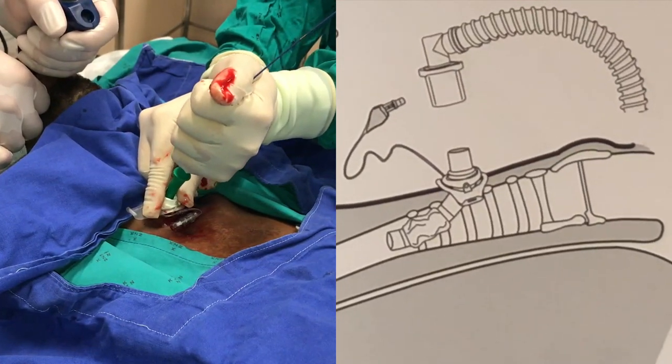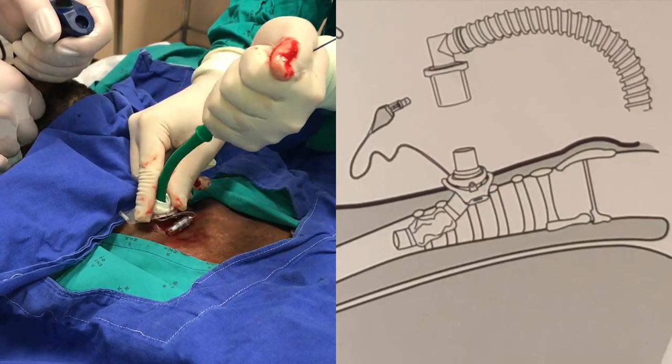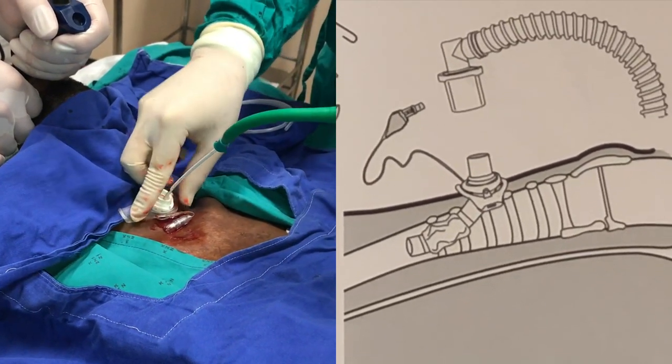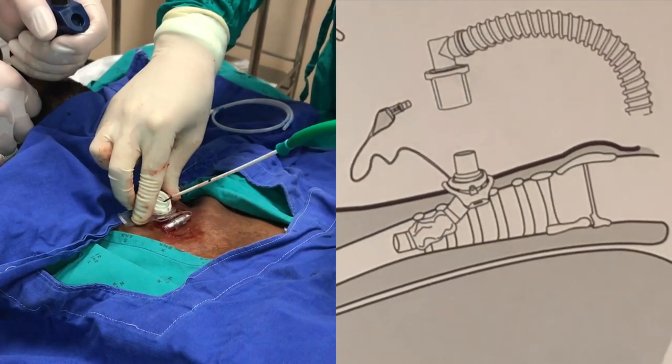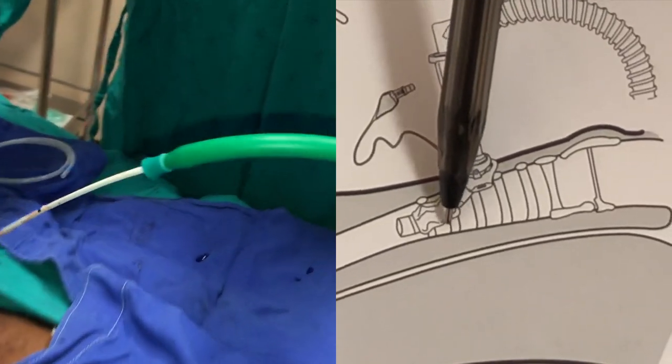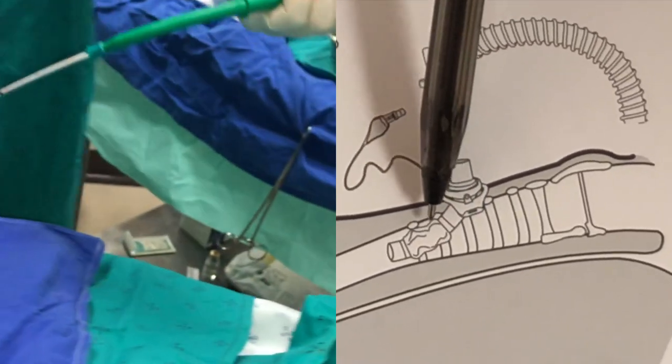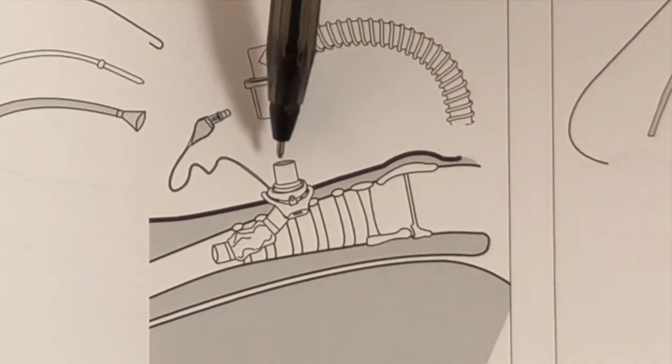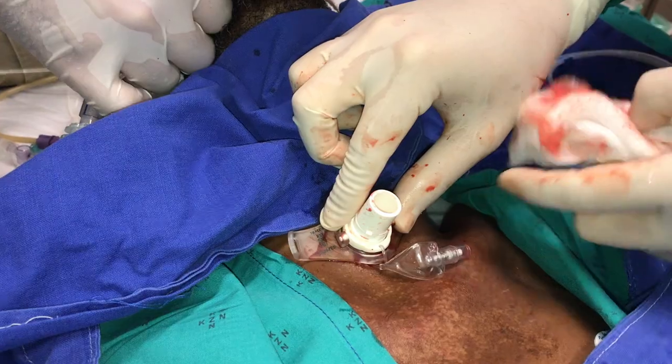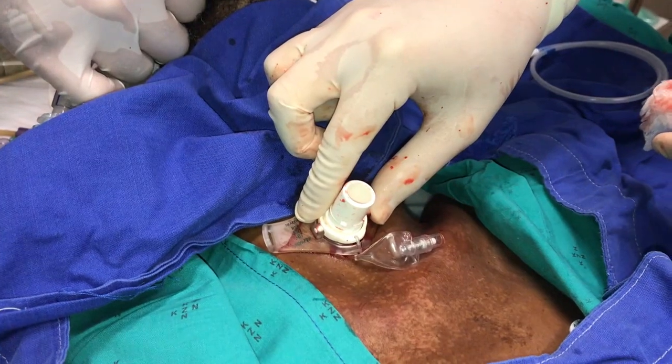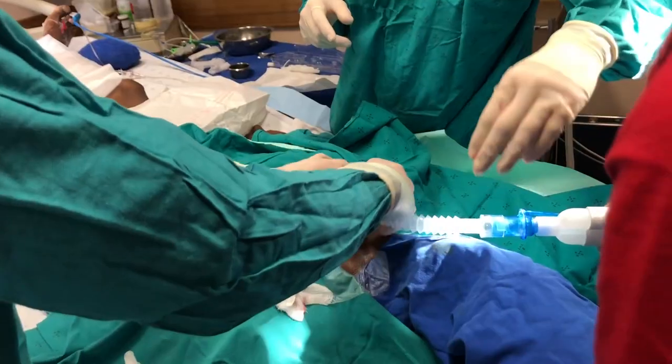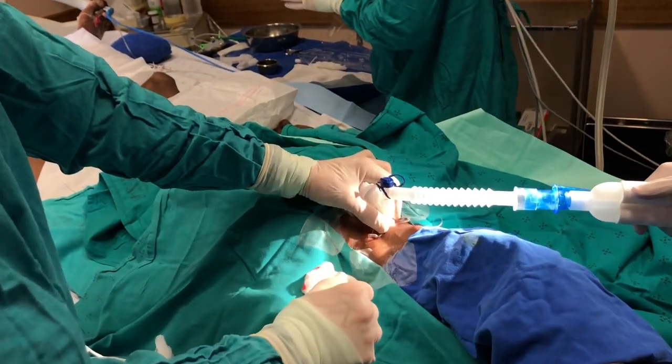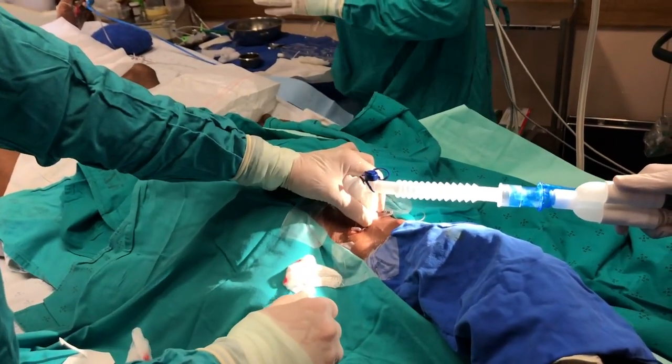Pull out together the green tracheostomy introducer, the guide wire protector, and the guide wire. I find it useful to prior to doing that inflate the cuff to give myself a little bit of security. Having removed those, inflate the cuff if you haven't already done that. Put the inner tube into the tracheostomy and lock it. Attach a sterile catheter mount to a ventilator. Confirm ventilation by chest rise and the return of CO2 on the capnograph.